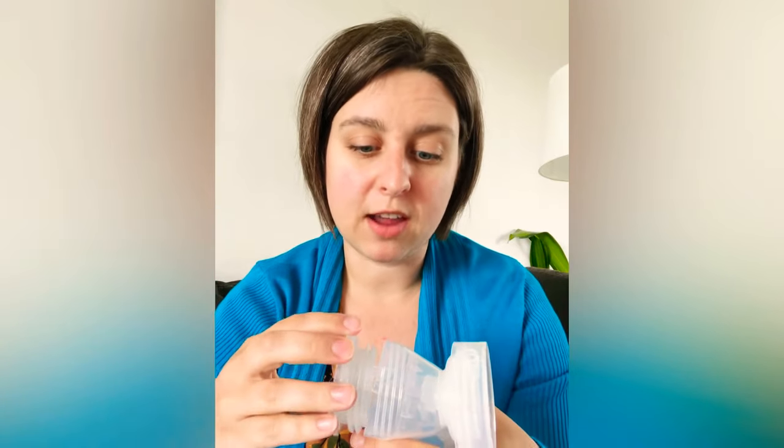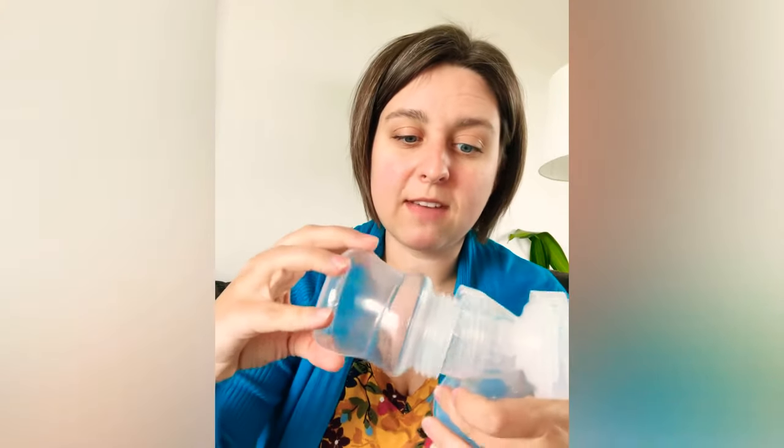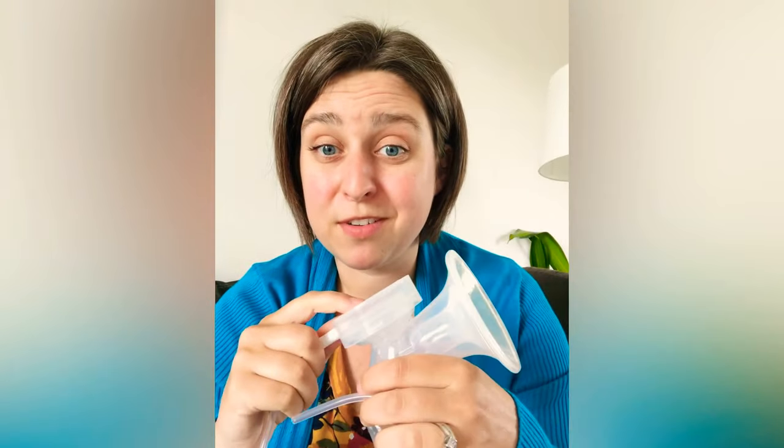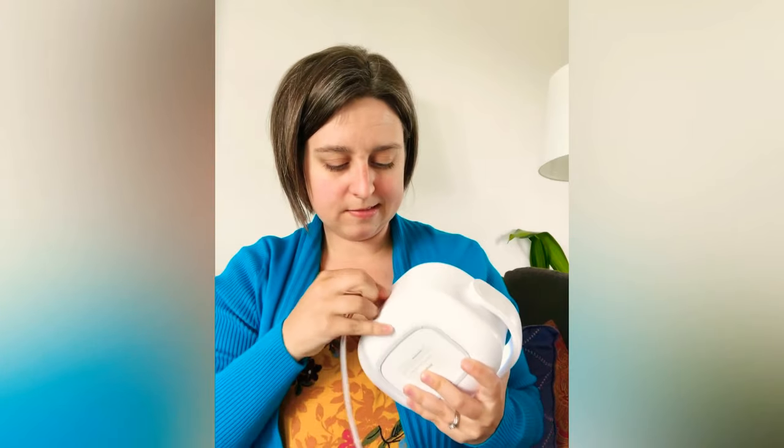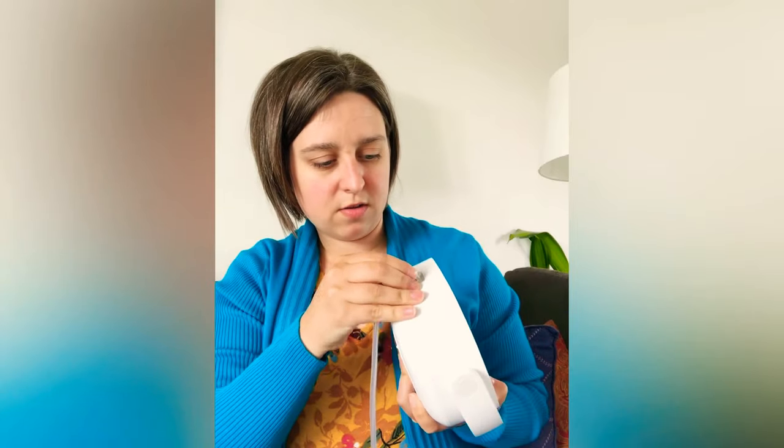This pump and its accessories are compatible with a ton of other pumps — this company has done a great job. They also sent an adapter so you can use a narrow-mouth bottle like a Medela. The bottle holds about four ounces. The tubing has a little connector piece that comes off, making it standard tubing, so you can use this pump with your favorite flange system as long as it's a closed system. I'm going to leave one side closed and do single pumping.